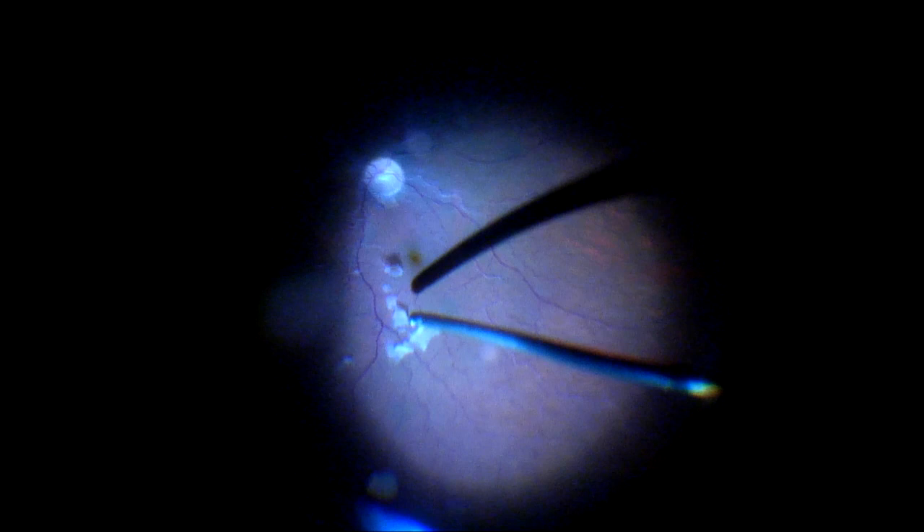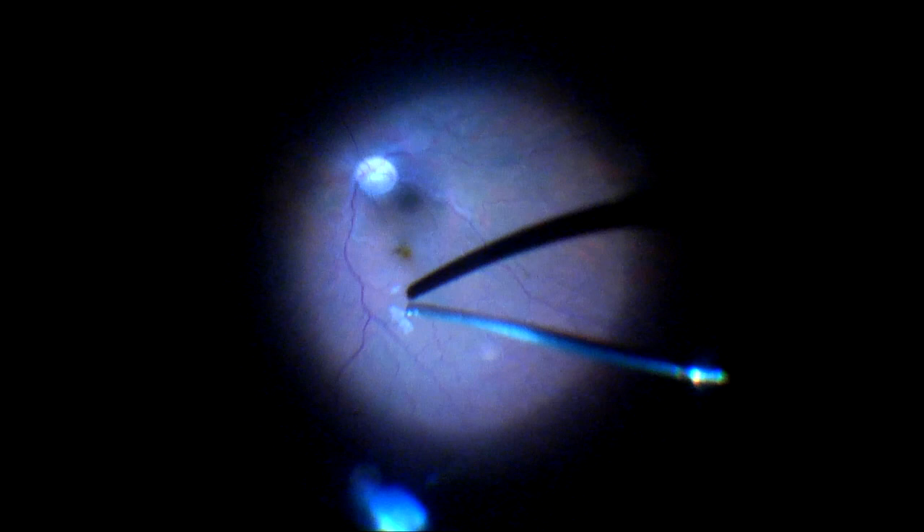We're getting through all of this particulate debris and cleaning this up. Here I'm using just aspiration because I'm very close to the retina. A little bit more peripheral vitreous dissection will be carried out to reduce the risk of retinal problems later on.